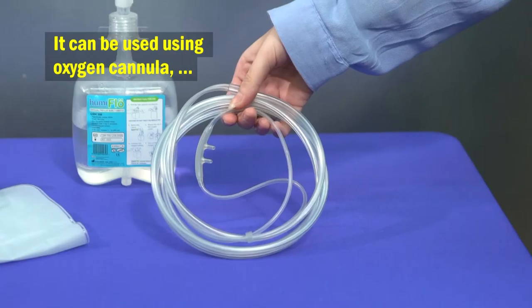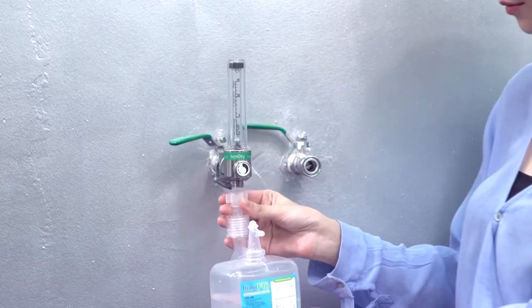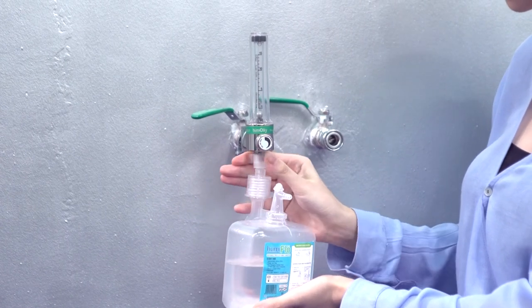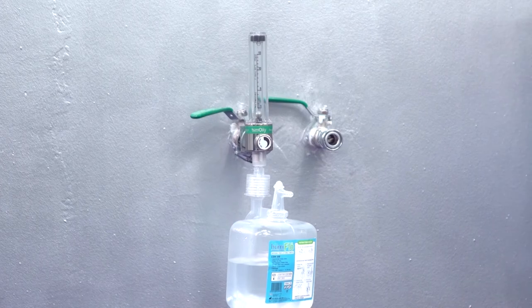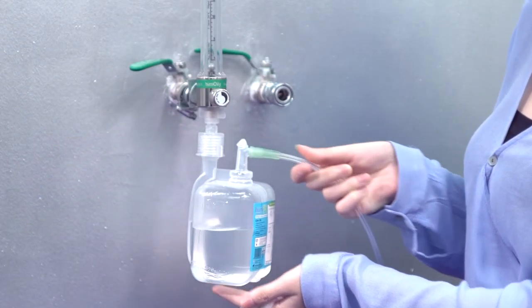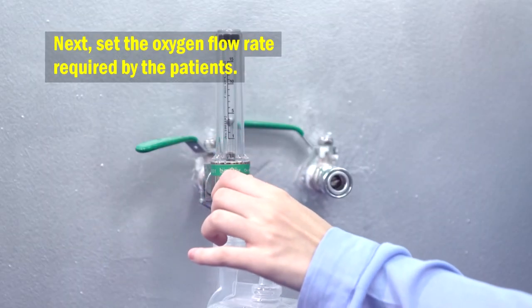It can be used with an oxygen cannula or oxygen supply tube. Connect Humiflow to the flow meter, then plug in either the oxygen cannula or oxygen supply tube to the nozzle. Make sure the connection is tight and tidy. Next, set the oxygen flow rate required by the patient.